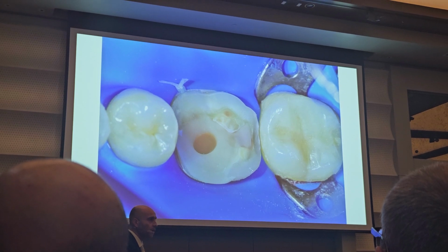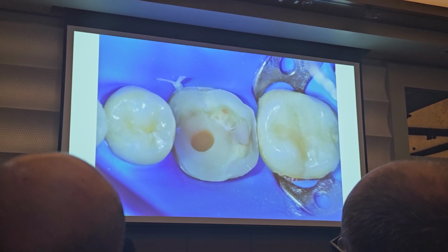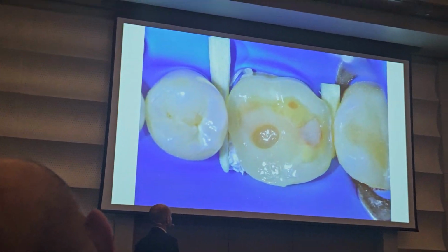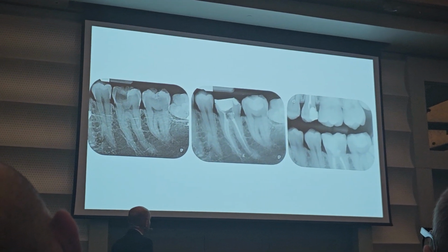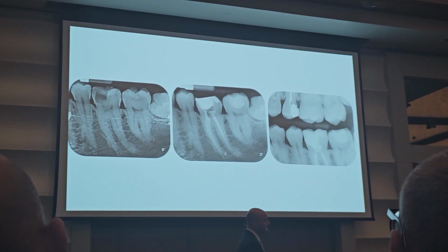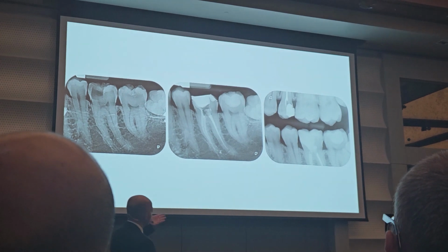You have to test the onlay before placing the rubber dam. Wedging, all the stuff, tape. Okay, you can see when you do a deep margin elevation, even the anatomy of the onlay is not easy to get. You have to accept some strange shape of the onlay.